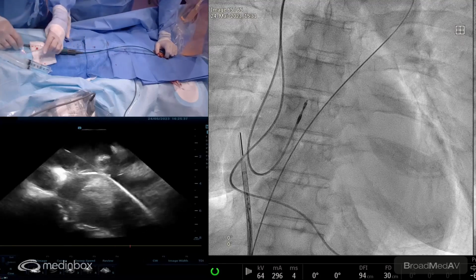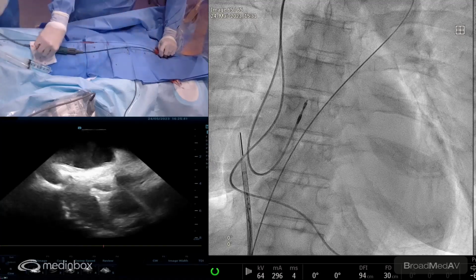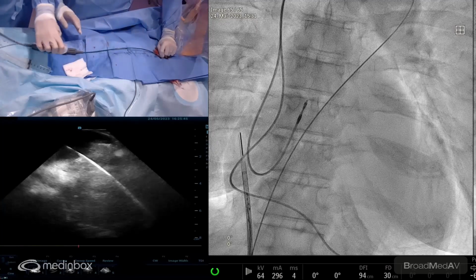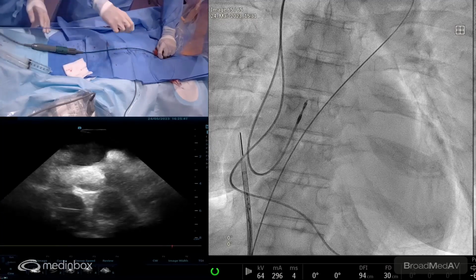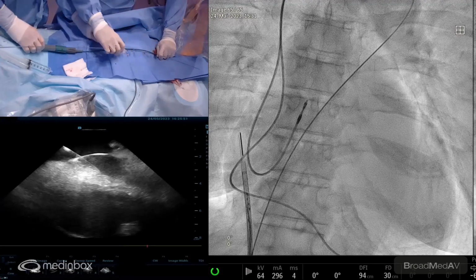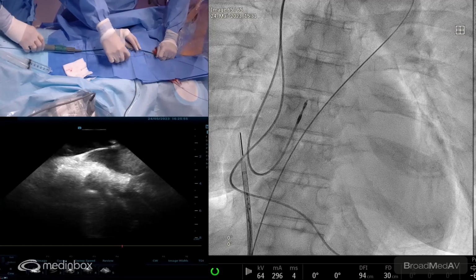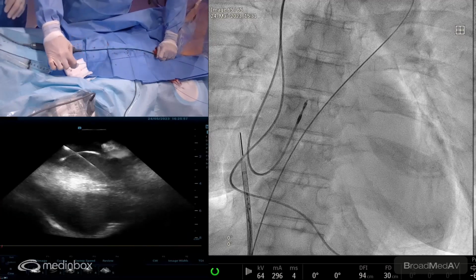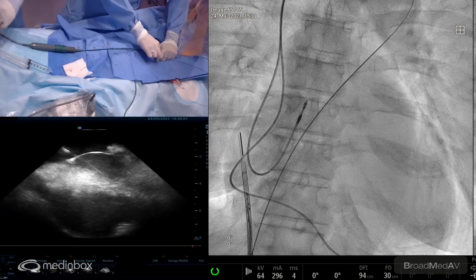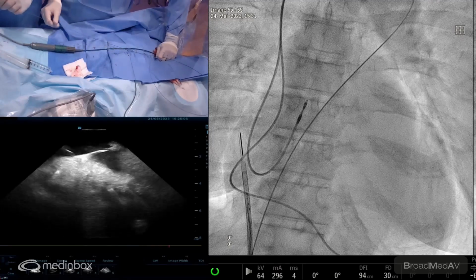If you follow the chart of the Amplatzer septal occluder, the device that we select for this closure, in theory, it goes in a 9 French delivery sheath. I typically select a delivery sheath that is at least 1 French bigger than what they suggest on the chart to have more room inside. So in this case, it's going to be a 10 French delivery sheath.